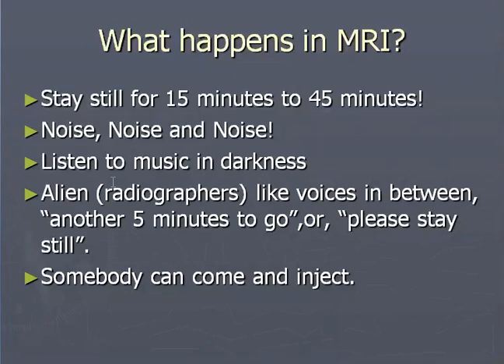Now they have invented other things so you can listen to music in the darkness and not bother about the gradient shout. And there are instructions, of course, like another 5 minutes to go, or please stay still. And sometimes when an injection of contrast is required, then somebody will come and inject and the process will start again.